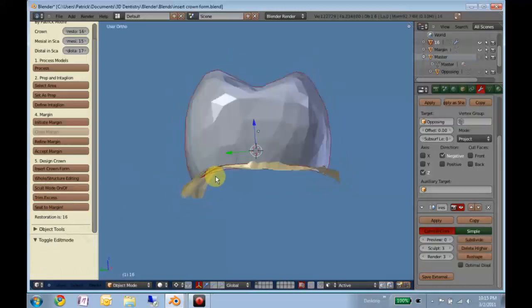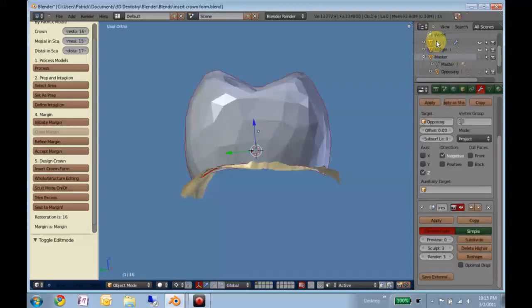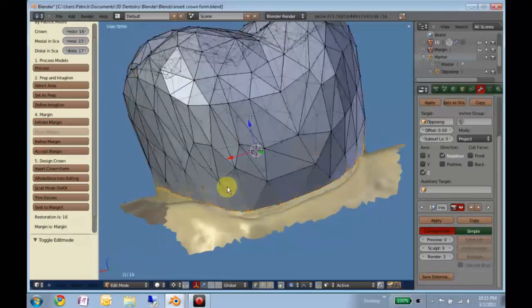Next thing we want to do is click on the margin to highlight it, hold down shift, and click on the restoration, so they're both highlighted. You can do this in the view, but it's a little tedious to try and click the line and then click on the crown. And we'll snap that to the margin. You can see it nicely seals it up.